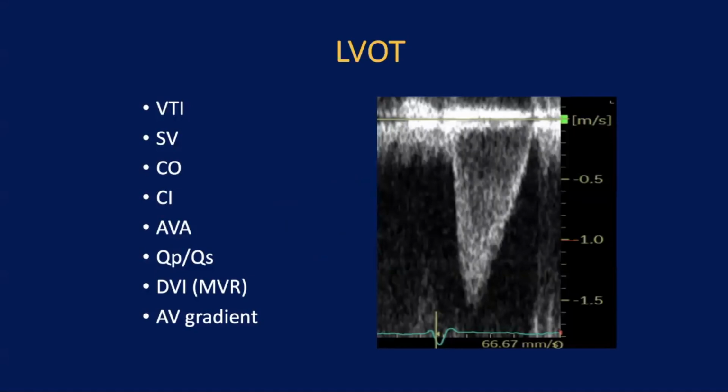By the way, VTI per se is a measurement of heart or cardiac function. Like in ICU, they will have a cutoff, I think around 12. Whenever the patient is below 12, he is in shock. No need, for example, when the images are sometimes difficult, no need to measure the area, no need to measure anything. If you cannot see the views of the heart, if the VTI is as low as 12, this patient is in shock. And it's really good to know sometimes just the VTI and to monitor the heart.